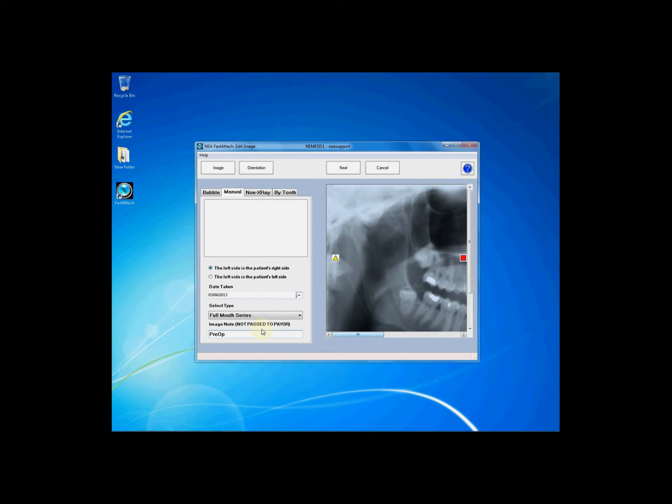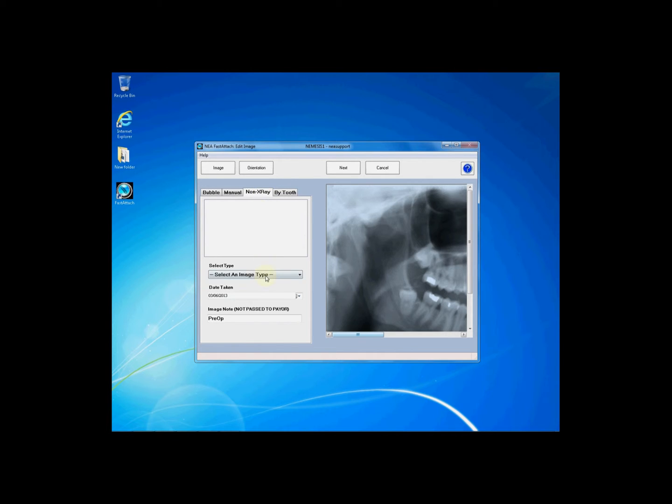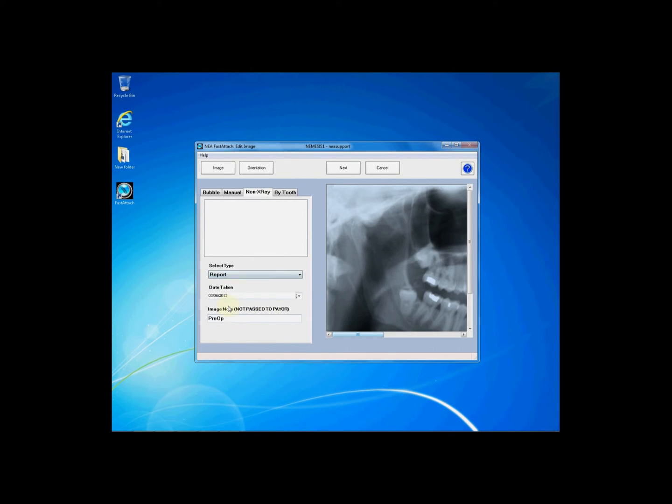If this is a non x-ray you will need to click on the non x-ray tab and then choose from the drop-down list to label appropriately. You may also enter an optional date taken or image note.